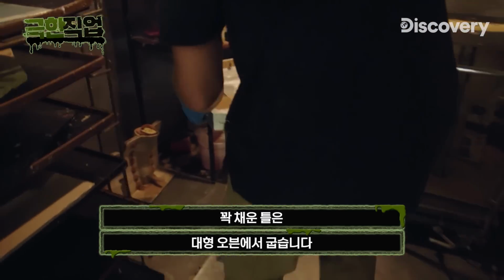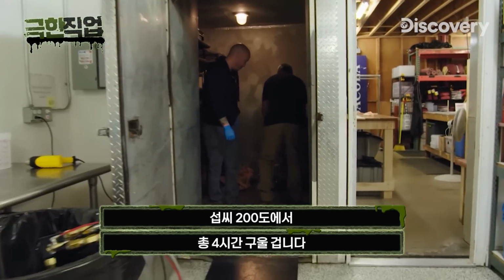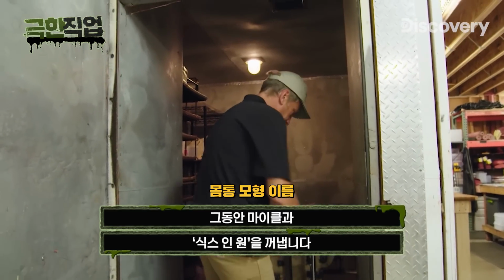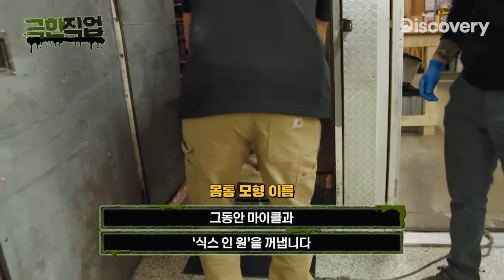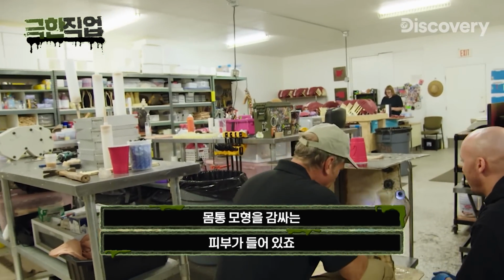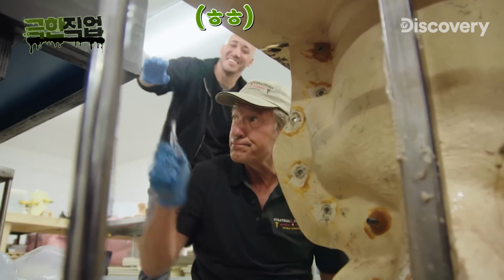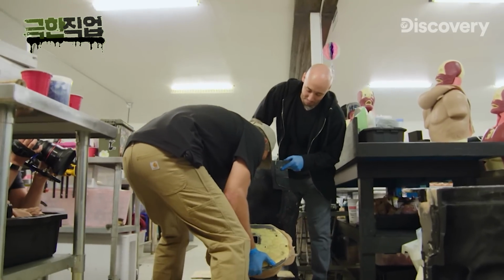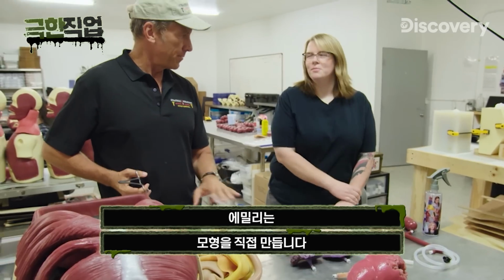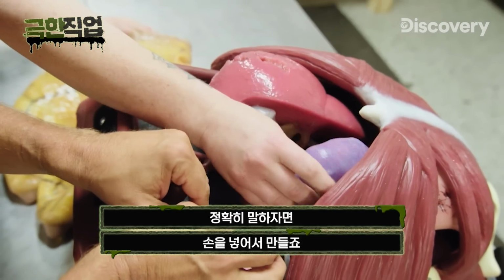Once filled, the mold is left to bake inside the giant oven. The parts will bake for 4 hours at 200 degrees Celsius. While in the oven, I help Michael wheel out something called the 6-in-1. Inside the 6-in-1 is the skin that envelops the cut suit. Emily takes a hands-on approach to her work, or hands-in, to be precise.